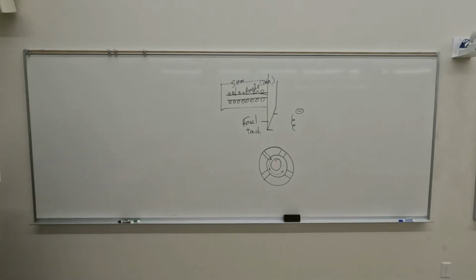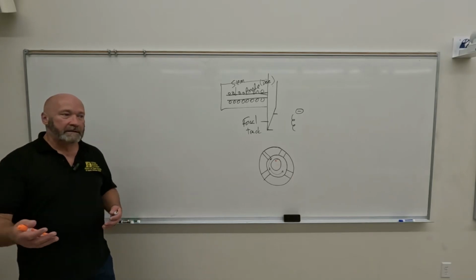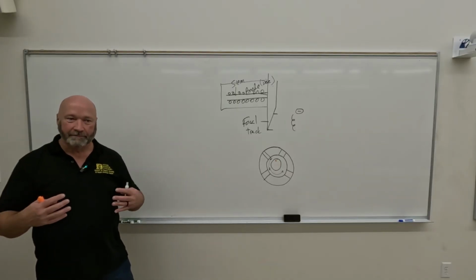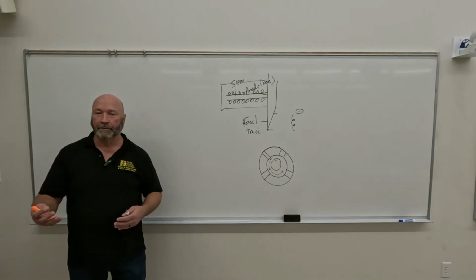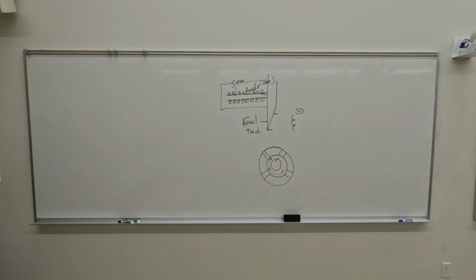All right. So the focal track itself is going to be made of tungsten primarily, but it's also going to have some alloy in it for the same reason that we talked about before, and that is because tungsten is very brittle. So we want to give it a little bit of strength. There are very few things that I'm going to say Bushong just isn't right about, but this is one of them.